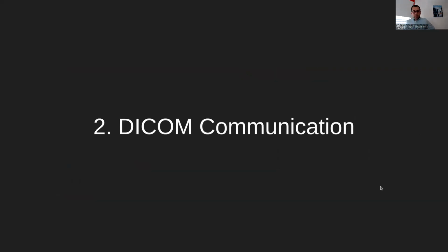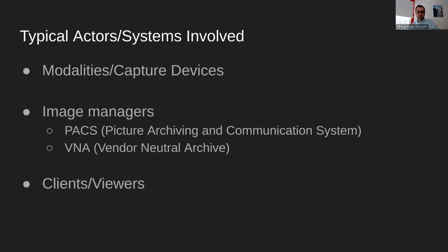Moving on to DICOM communication. So remember what I said about DICOM Part 10 files? That's typically what a lot of people see when they're first exposed to DICOM. They see DICOM Part 10 files, and they assume that this is DICOM, that maybe people are emailing these files back and forth, or putting them on shared drives or something. We're absolutely not. There's some pretty serious chatter happening in the DICOM world between devices as they work these things through. That's all part of the standard.